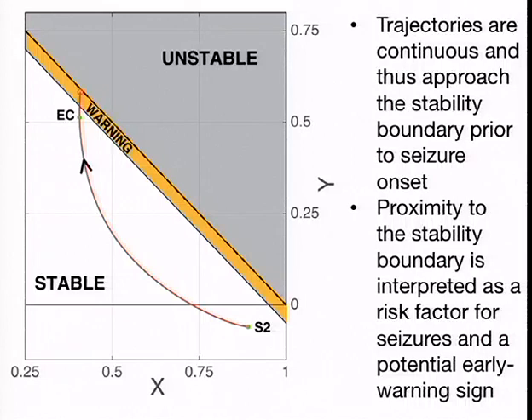So that actually leads to my question. REM is very hard to differentiate from being awake if you're only looking at cortical power spectrum. They're not the same, and we know that there are some other nuclei that could be hooked into your model that are very clearly differential.